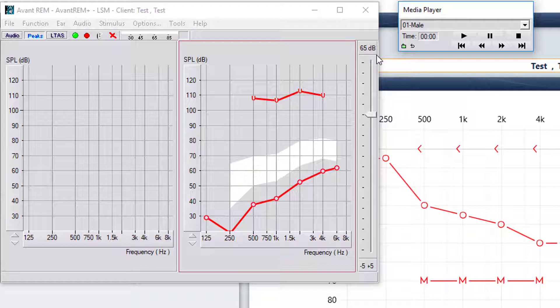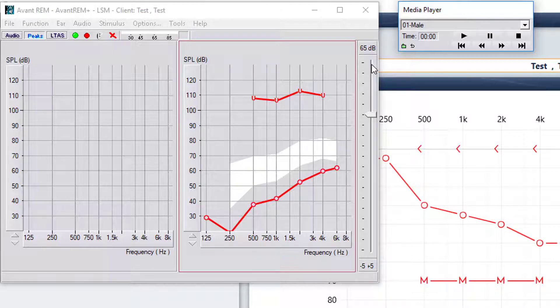So we'll go ahead and insert the probe tube into the ear and we're going to run an unaided response first.